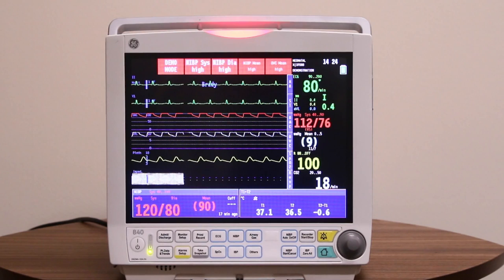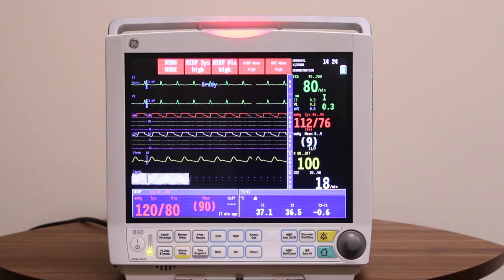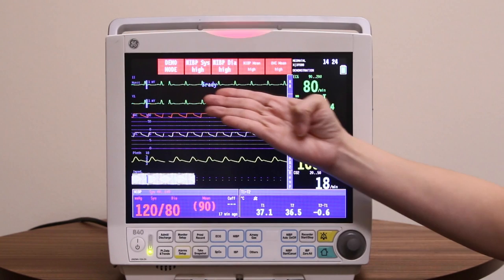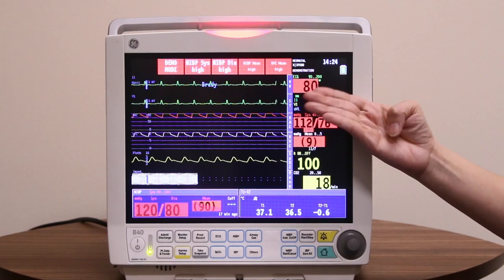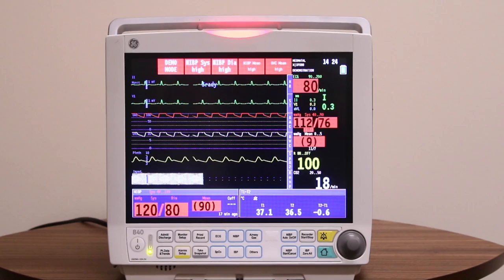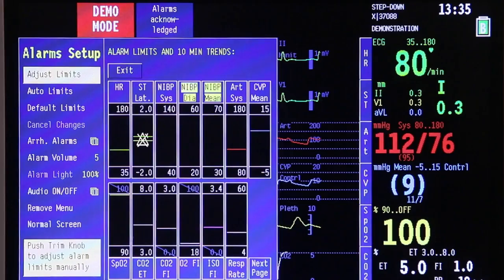The B40 patient monitor provides both audible and visual alarm notification. Alarm messages can be displayed in three areas of the main screen: the message field on top, the waveform field, and the measurement digit field. In addition, the alarm light on the frame of the monitor also flashes during an alarm. While the alarm light is flashing, you will also hear the audible alarm on the monitor. Selecting the alarm setup key on the command key panel will open the alarm setup menu.